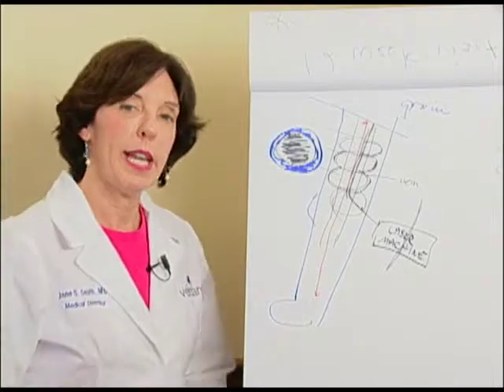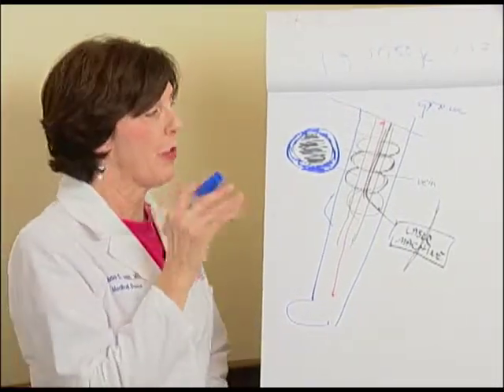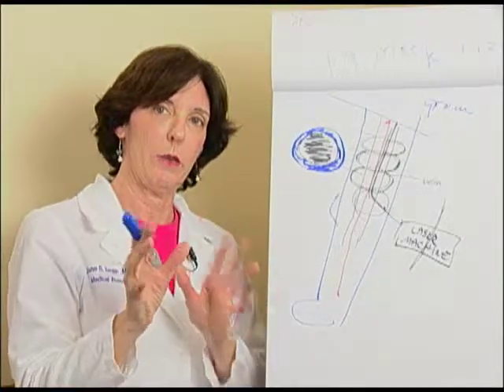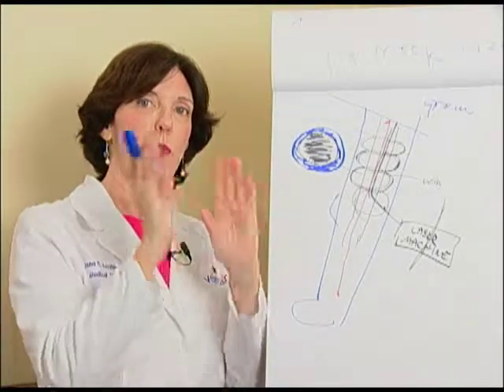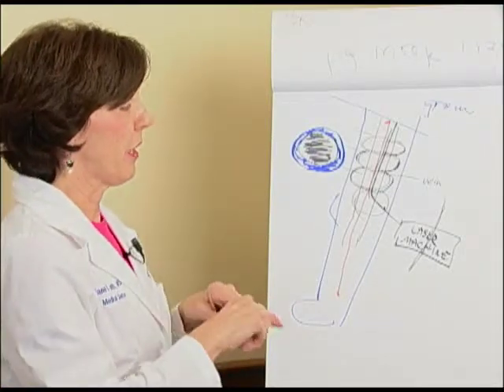I can count on one hand, I've probably done 2,000 or 3,000 lasers, and maybe 3 or 4 times people have felt a little bit of heat. If they do, we stop, we put more fluid in, okay? So now you're good to go.